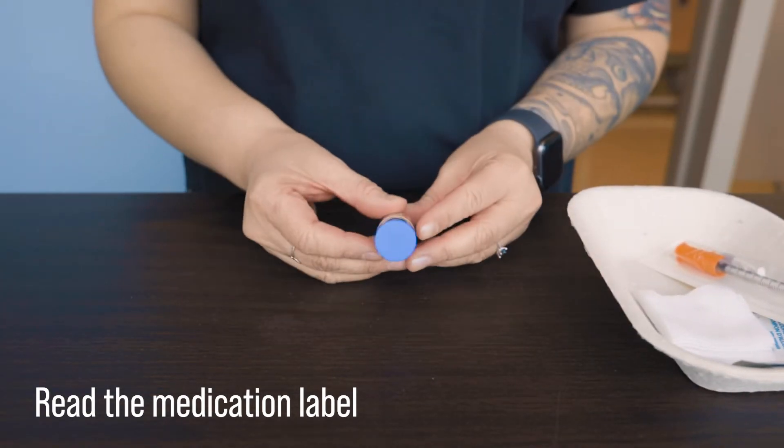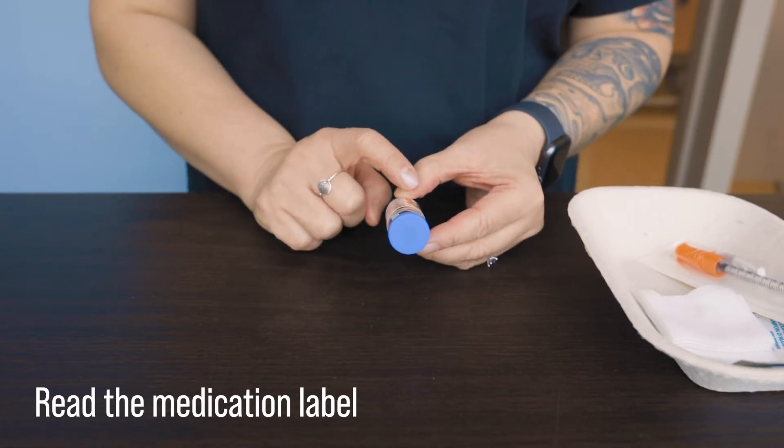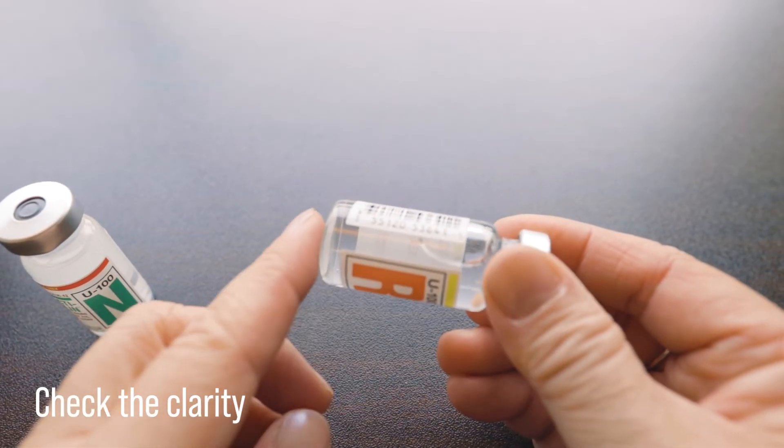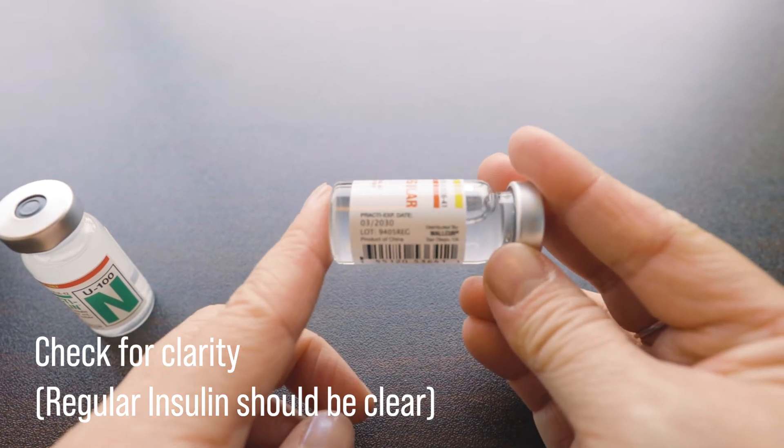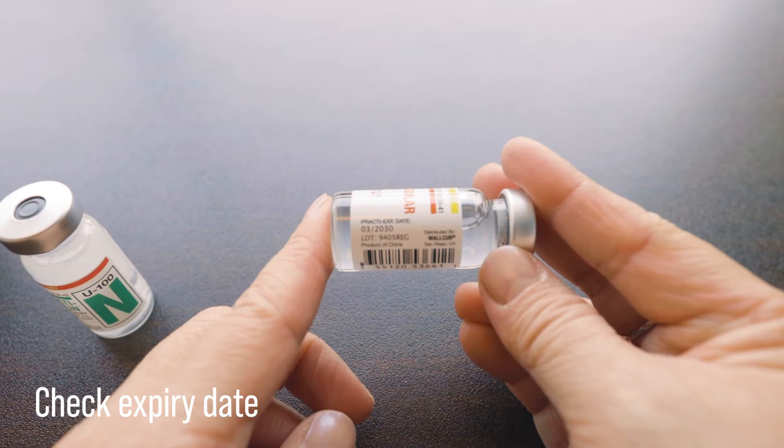Here we are reading the medication label. For this vial, it reads U100 Insulin R. We are checking the clarity of the solution. Insulin R should be clear and colorless, and the expiry date is March 2030.